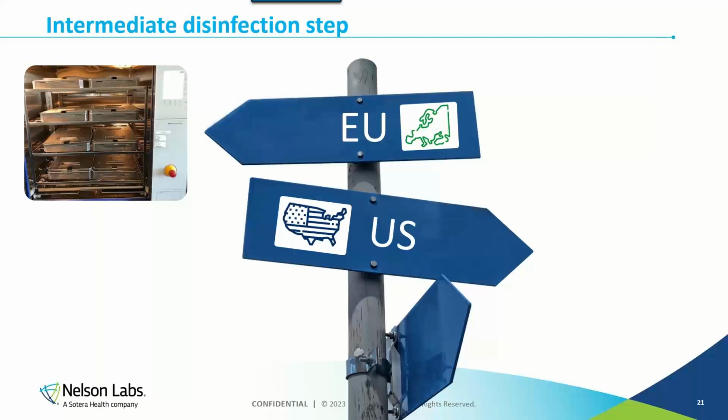So in terms of intermediate disinfection, for Europe, regulatory authorities will ask you if you have automated cleaning, and remember, if your device can withstand it, you have to. And if you have this process, you also have to include a thermal rinse. So you have to include a disinfection step as part of that washer disinfector program. This is really something that's more targeted towards the safety of the healthcare personnel, but this is definitely something that you will be asked for.